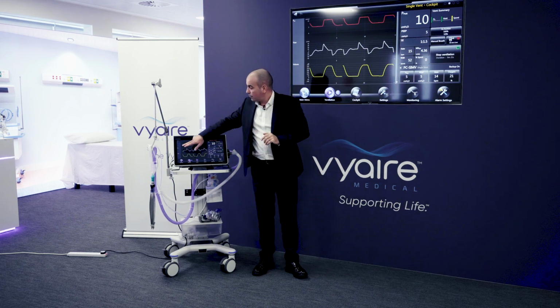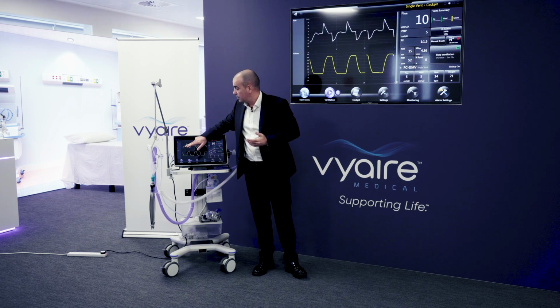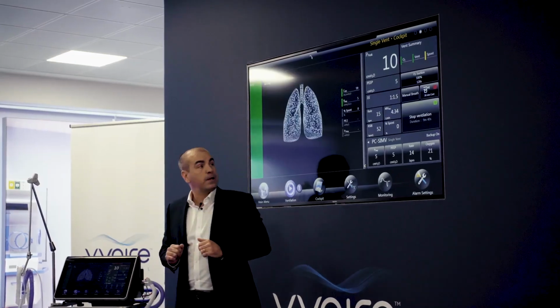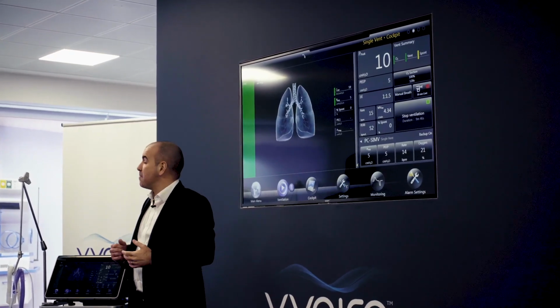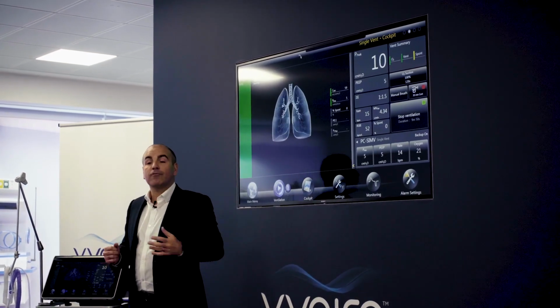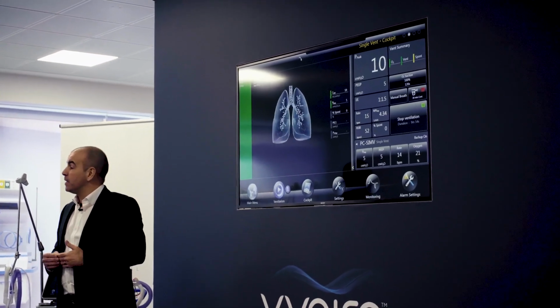So for instance, rather than having the waveforms, which take years to master, we could actually replace this. We can put what we call our animated lung. So it's a great visual cue for ICU clinicians that are busy. The demand on the resources is always increasing, and the supply of resources in terms of staffing doesn't always necessarily keep up.